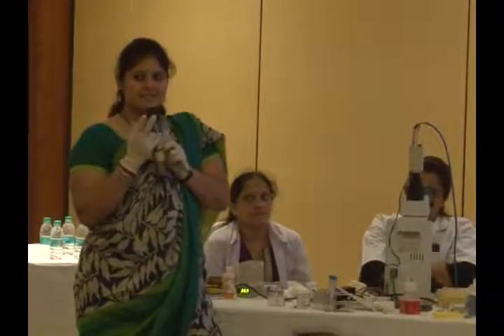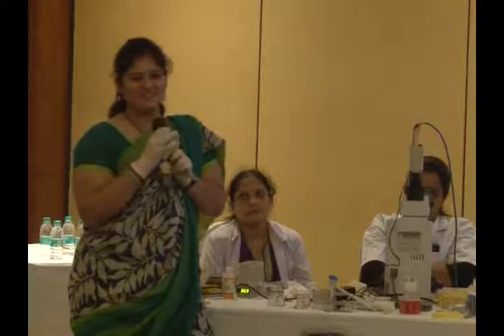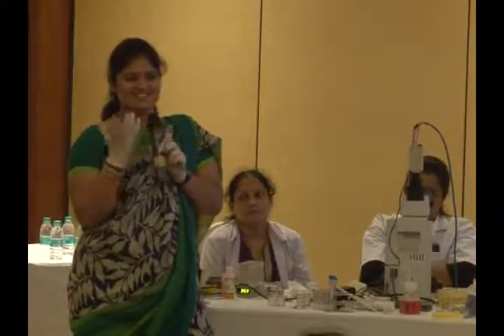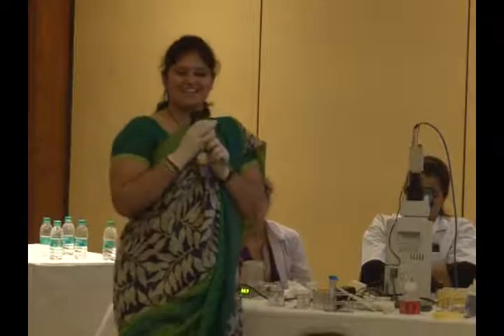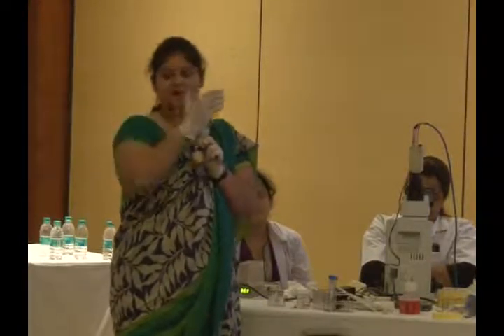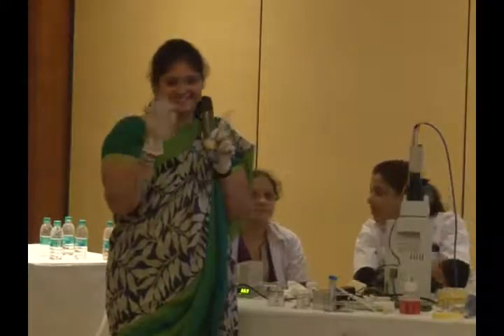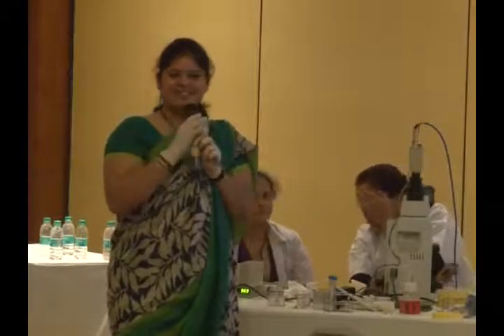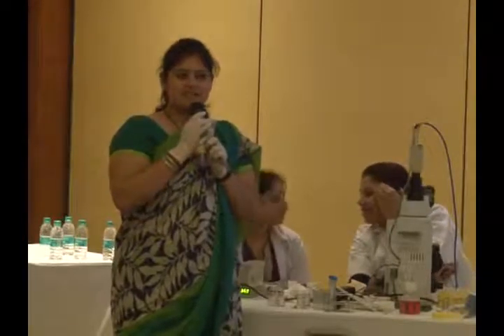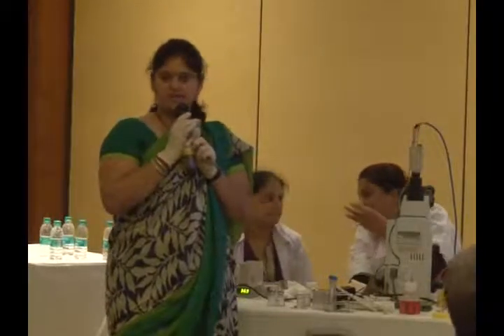And the second thing is contamination. Big point I have made, I know. If mixing of samples happens, then you can create so many problems. So that is the reason. Of course, if you mix the sample of a fair person and a dark person, then anything can happen. Anyway, leave that part apart. To reduce contamination, always use one sample at a time.